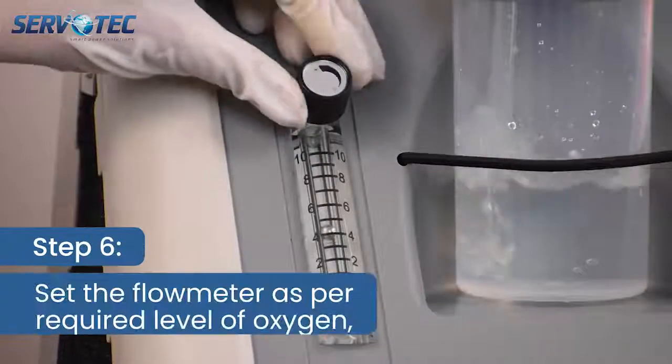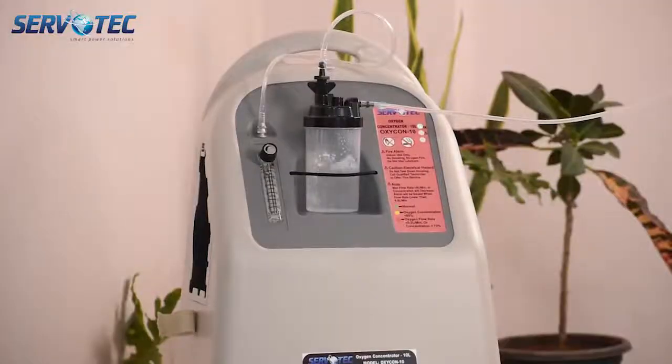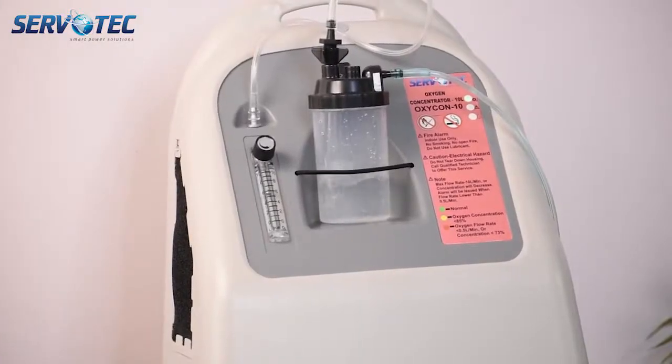Step 6. Set the flow meter as per required flow rate of oxygen. Please ensure LED indicator shall be green for normal oxygen concentration.